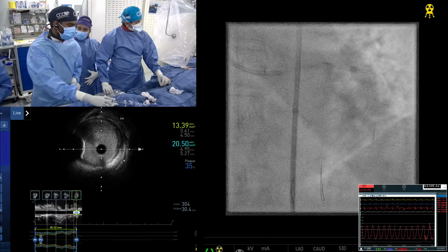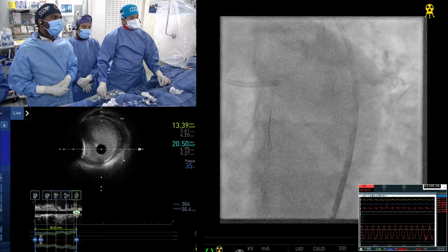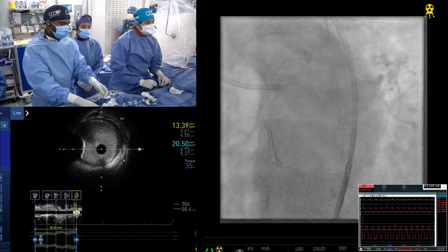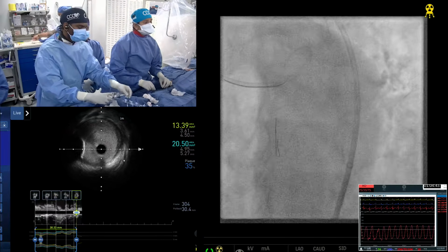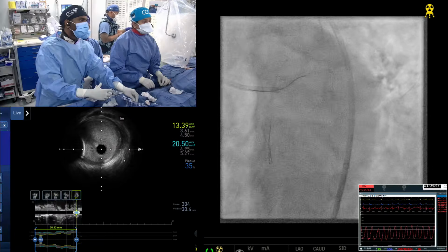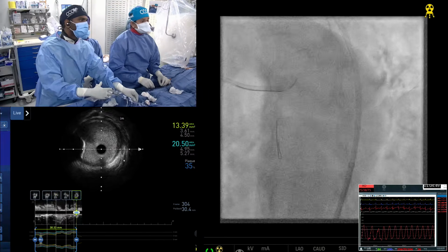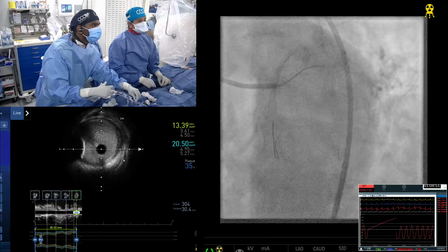We do not have that even in our imaging, and we actually did the study, and for nodules IVL works very well. Our non-randomized data, which we published, actually gave a bigger lumen, but now with the randomized data we'll learn from Nodule Shock. But all can be used. There's no question on that point, including orbital.